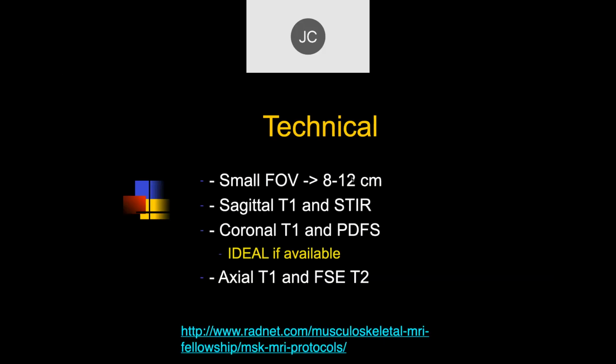As you all know, we typically in the foot and ankle have two protocols. We have an ankle protocol, which usually does not include the base of the metatarsals, just the ankle and hindfoot. And then we have a foot protocol, which typically has the toes and metatarsal bones in it. If you try to image the whole foot and ankle, then the resolution, I think, is insufficient to make some of the diagnoses we're going to talk about. So it's generally one of these two, and a lot of clinicians, if they're concerned about the whole foot and ankle, will get both studies.